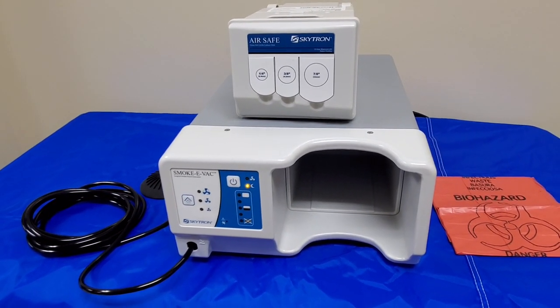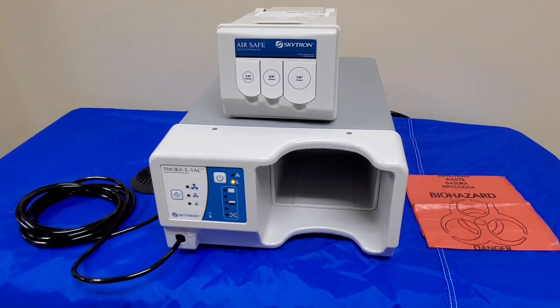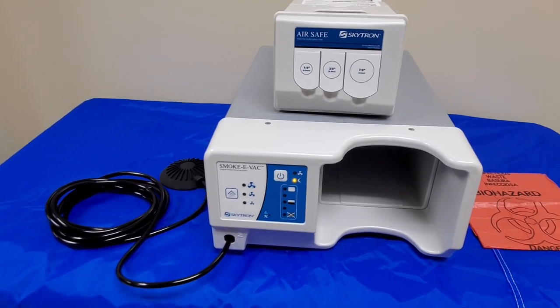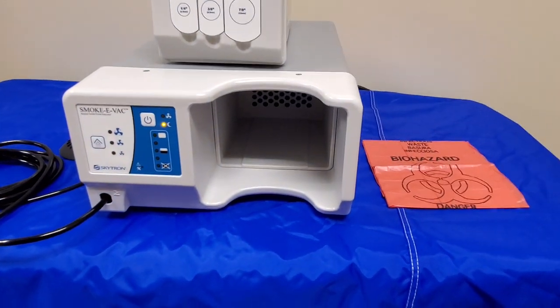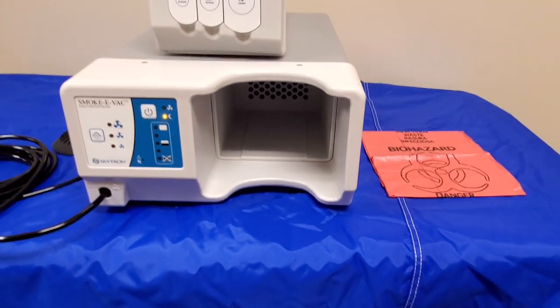Hi everyone, welcome to the Skytron Smoke Evac training video. Today we're going to go over how to set up and how to use one of these Skytron Smoke Evacuators. These devices are going to be placed on booms and close to bovie stations so that you do not inhale all those harmful smoke fumes from when you're bovying patients.